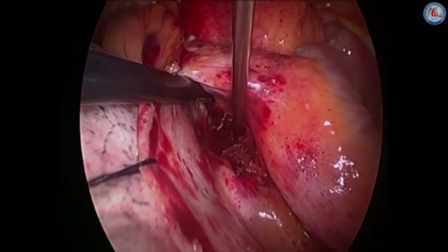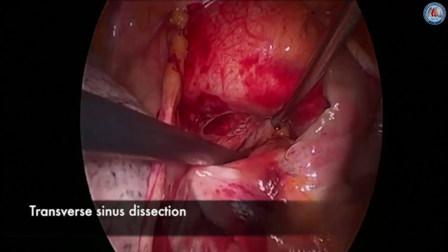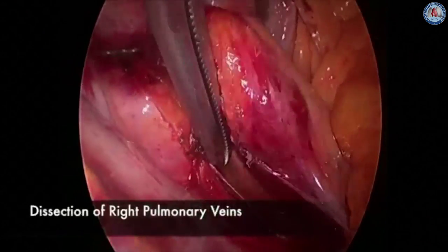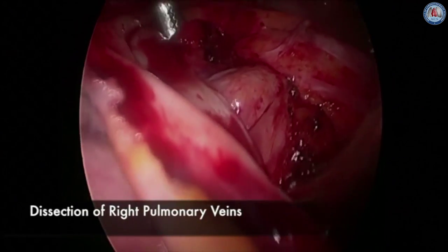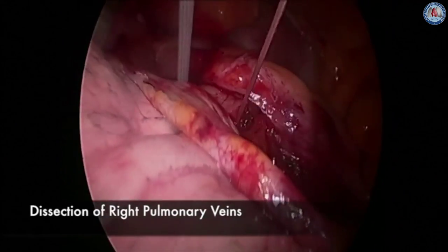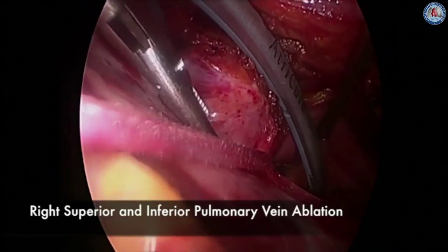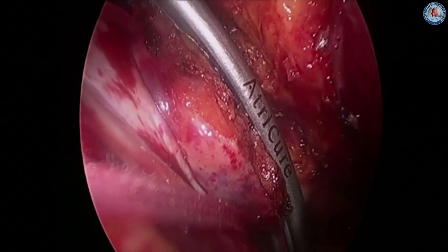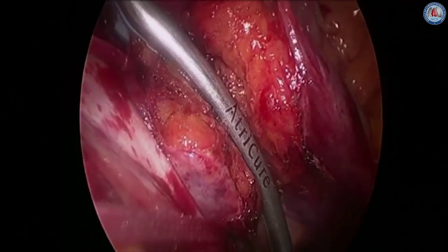The dissection is then carried out into the transverse sinus under the superior vena cava, which allows visualization of the left atrial appendage underneath the aorta. The clamp is then passed around the right pulmonary veins and an umbilical tape is used to surround the right pulmonary veins. This allows for a much safer passage of the bipolar radio frequency clamp, which is used to isolate the right veins. Care is taken when using this clamp to get as large a cuff as possible of the surrounding left atrium.